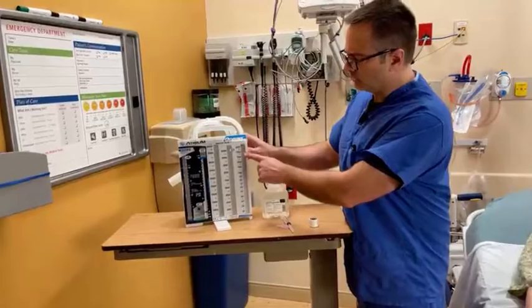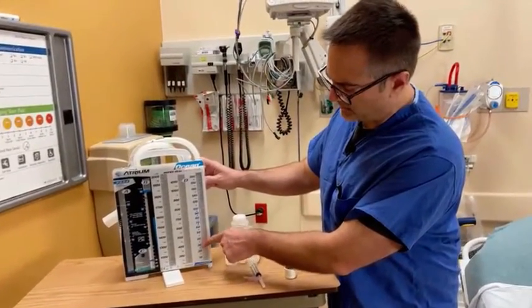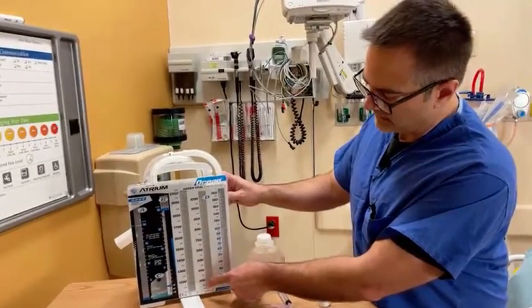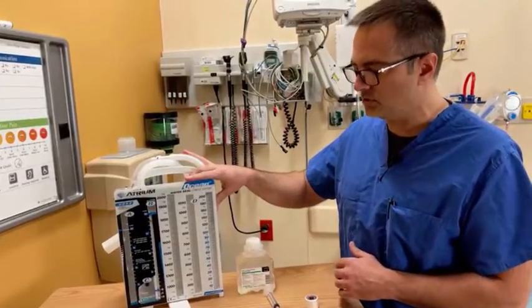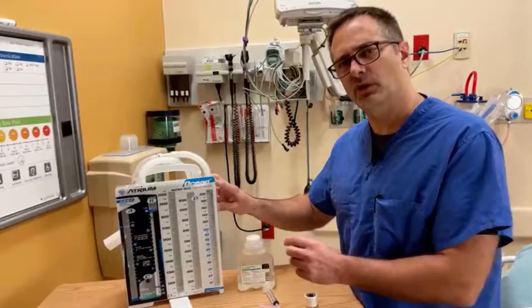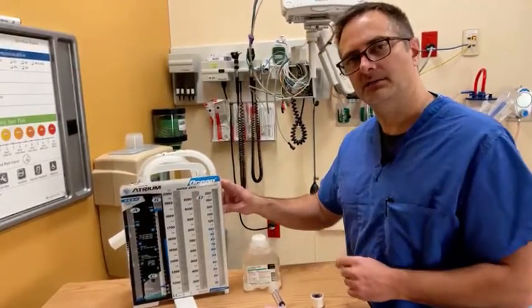The first chamber I'm going to look at here is our collection chamber. You can see the graduated markings for us to document the amount of output from the patient. This is a really important point: whenever we insert a thoracostomy tube and hook it up to our chest drainage system, we want to know how much drainage is coming out when we insert the tube, as well as on an hourly basis.